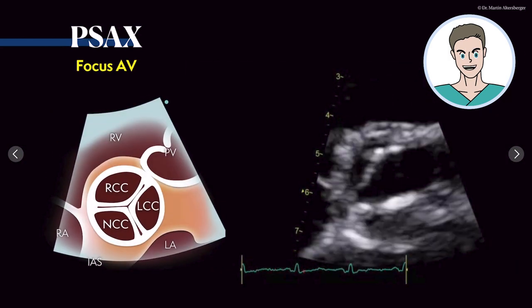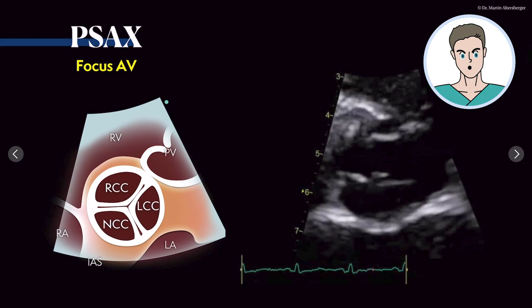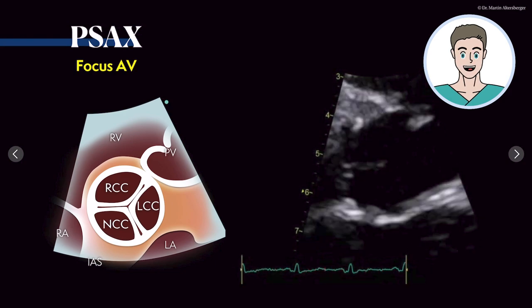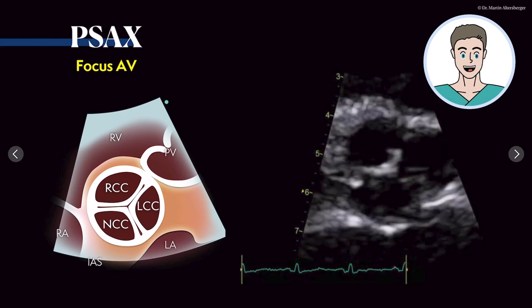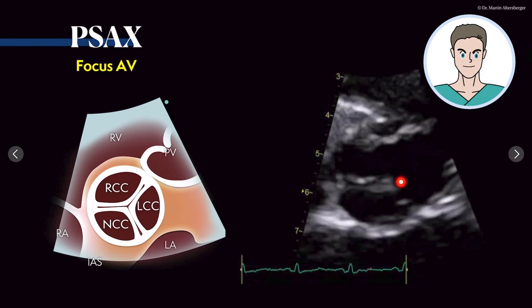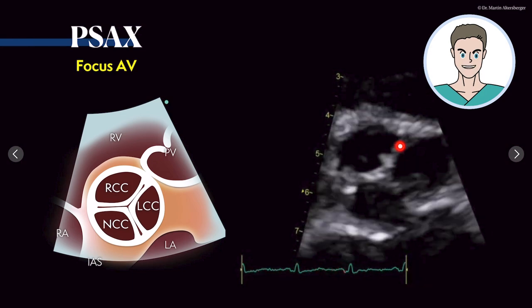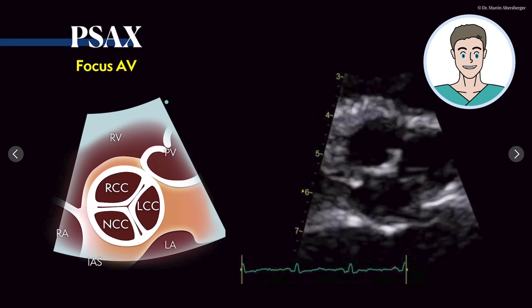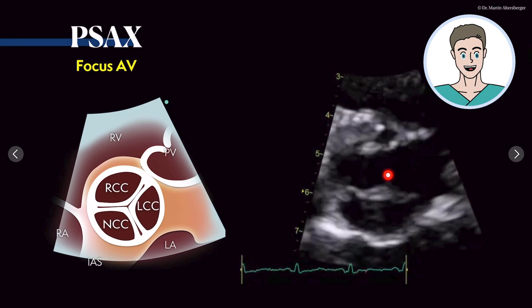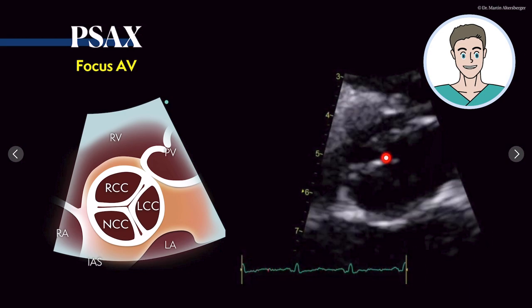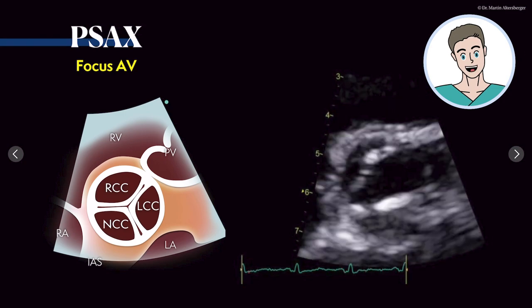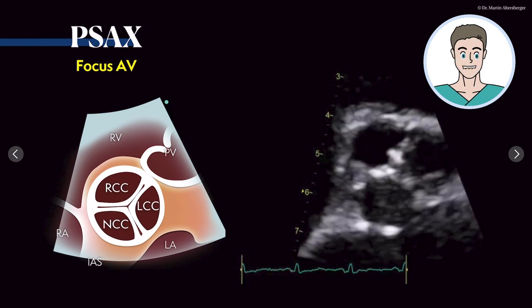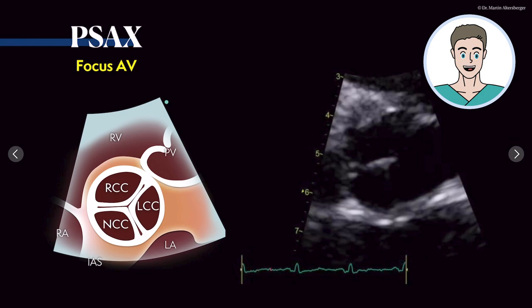Also in the parasternal short axis you include a focused view of the aortic valve where you see all three cusps again, and you can appreciate that the cusps here are sclerotic. There is a little bit of calcification, but overall the opening is preserved. So this is most likely not a severe aortic stenosis because the opening seems preserved.